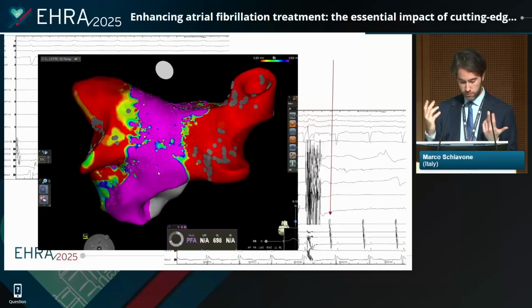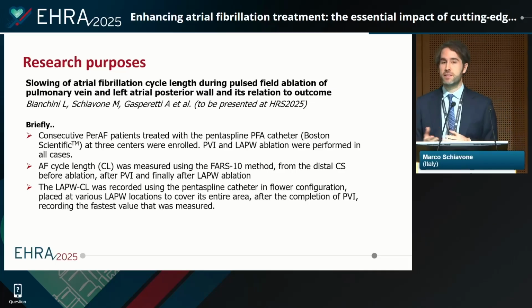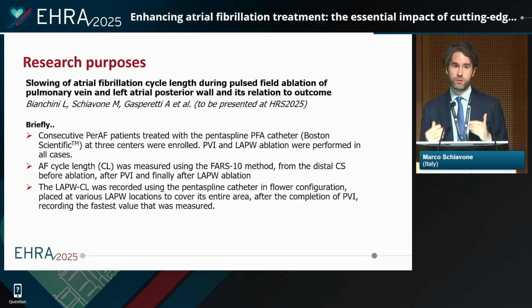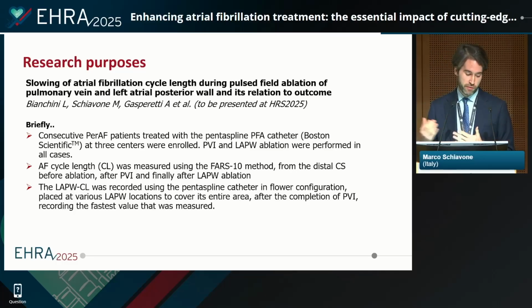And this is the post-ablation mapping. And those are the signals in the vein. The novel filters are useful also for research purposes, not only for clinical purposes. Unfortunately, I cannot present the data, but I just want to present the idea behind this abstract and this hopefully paper that we are going to present at HRS 2025.